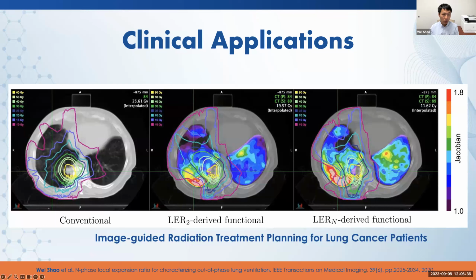By doing image registration, we can actually obtain the motion of the lung, so that we try to minimize the radiation dose to regions with higher motion, since those regions are healthier than other regions that have lower motion. By doing so, you can minimize irradiating those healthier tissues, and therefore minimize the damage to the lung. So this is one more application of image registration. For our prostate segmentation task, image registration will serve a different purpose, which I will explain later.